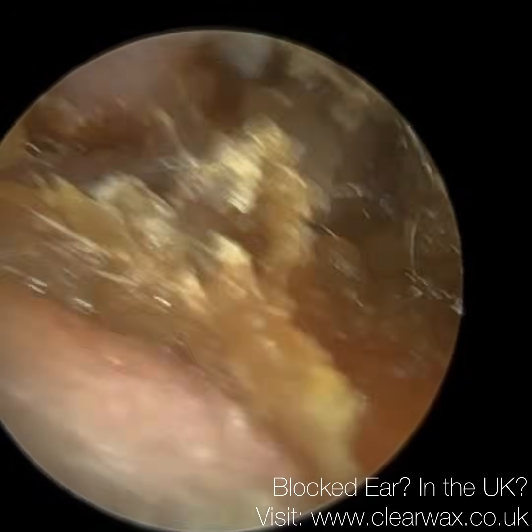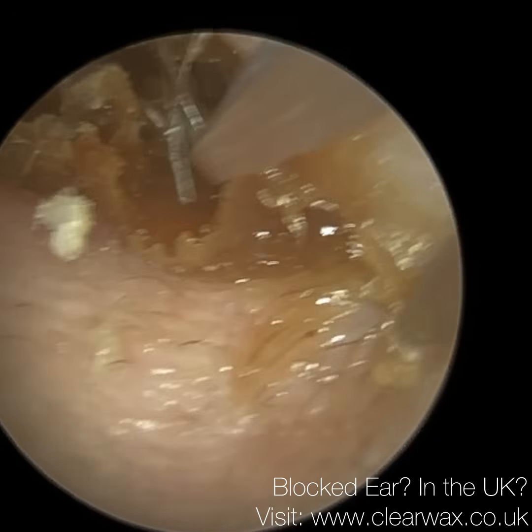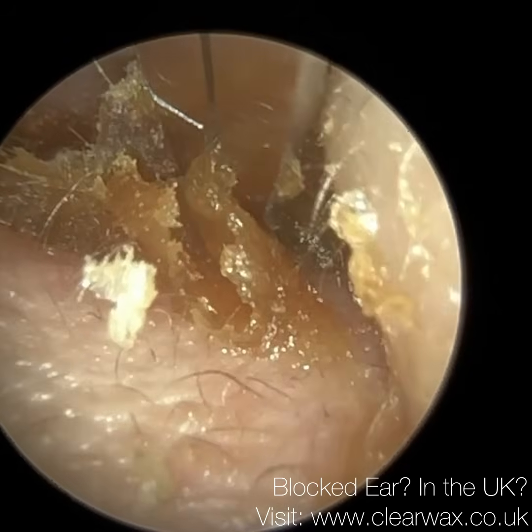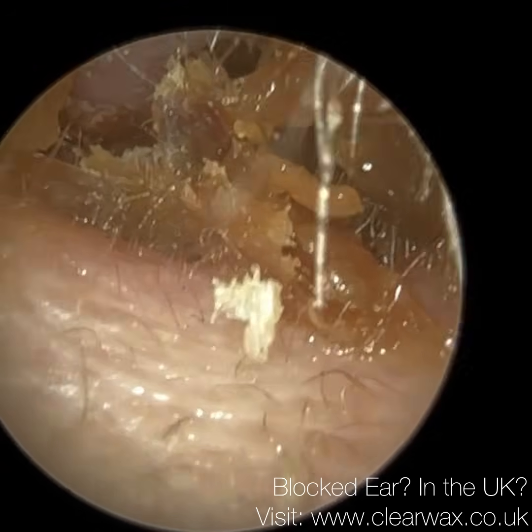But this patient is a regular patient. They come every year, 18 months. So I already know they've got this condition called benign osteonecrosis. And essentially what we need to do is elevate skin from a widening that's occurred at the bottom of the ear canal as a result of their pathology.